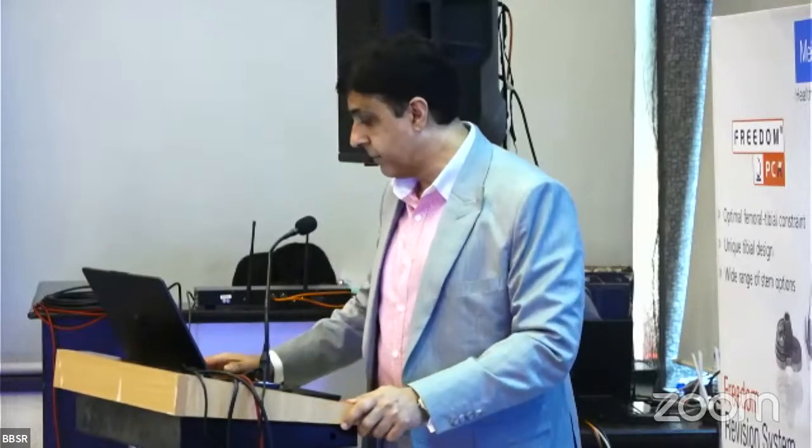So I had done a huge volume, but I never had any other patient coming back to me with this. Neither did I discuss it with the company. They had listened to these kinds of parameters. But there are certain rare parts for which you don't have an answer. Whenever you move in for these kinds of cases, you should always be mentally ready to have a backup of a stage 1 with you, because you might find some focus of infection on those parameters.